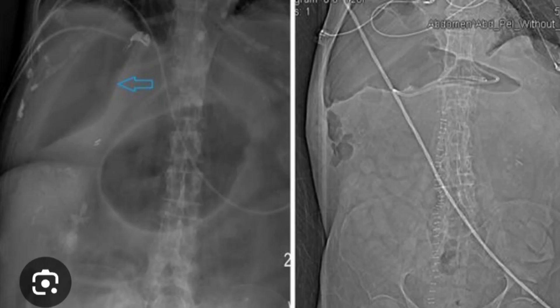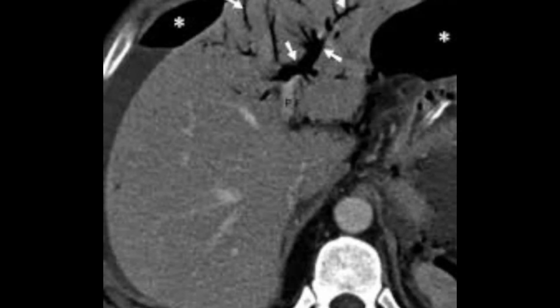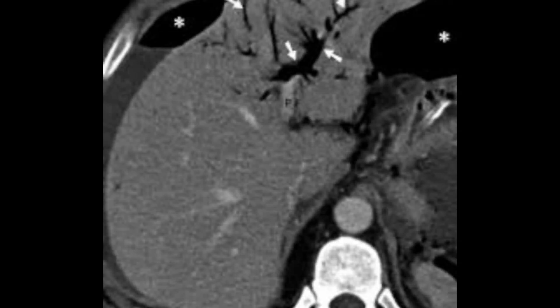On the right upper abdominal quadrant, another sign called the lucent liver sign can be appreciated, caused by the presence of free peritoneal gas and pathognomonic for pneumoperitoneum. On the CT abdomen image, periportal gas is visible indicated by the white arrows, and this is a confirmatory sign for pneumoperitoneum.